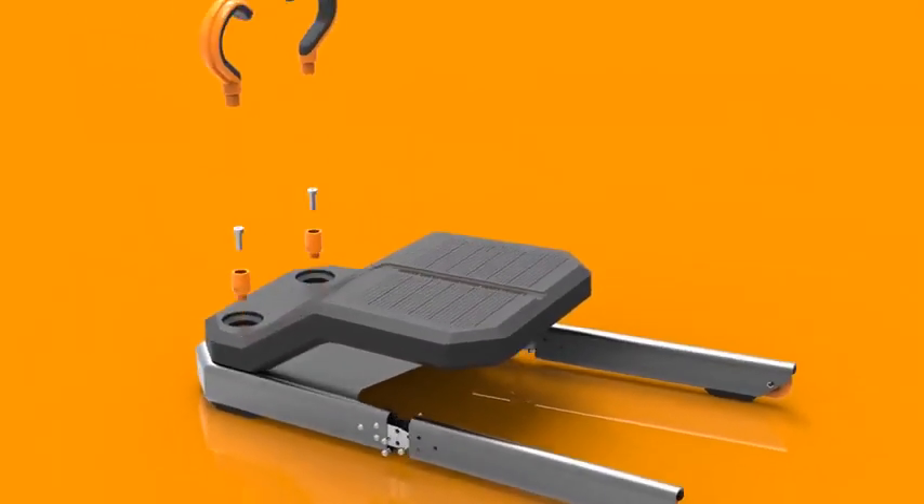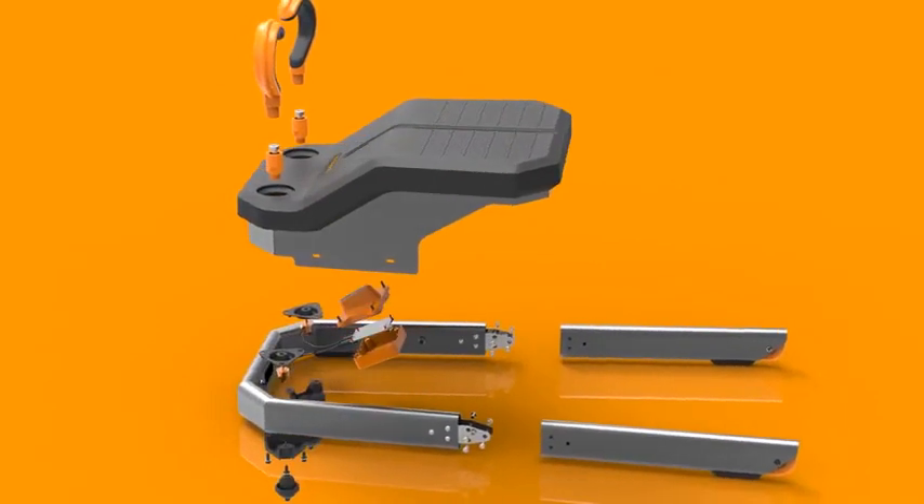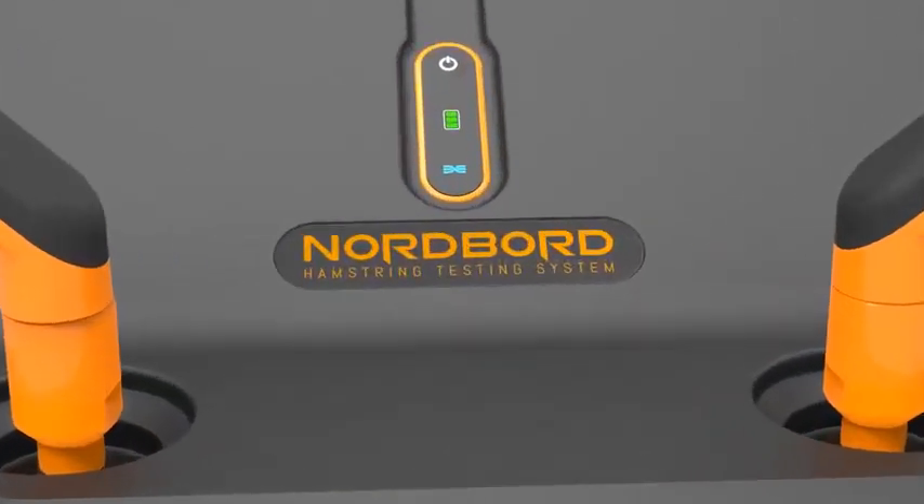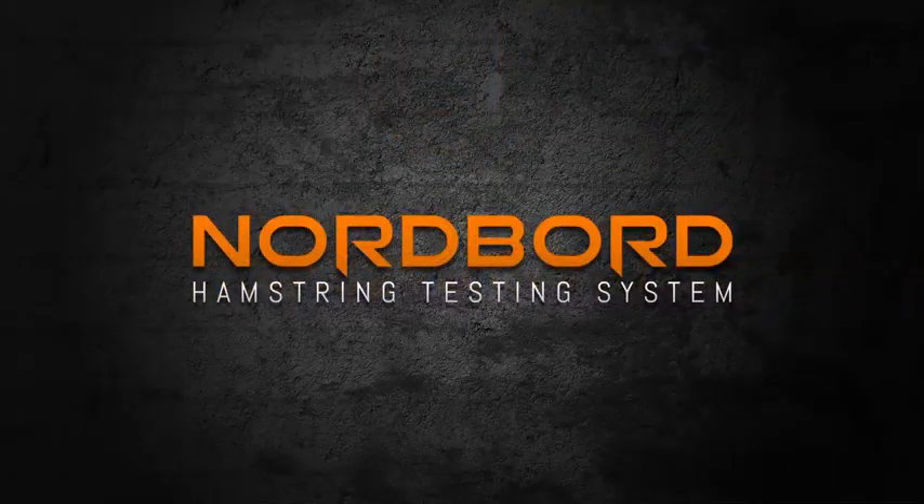Introducing the Nordboard Hamstring Testing System. To get yours and get on board, contact VALD Performance now.